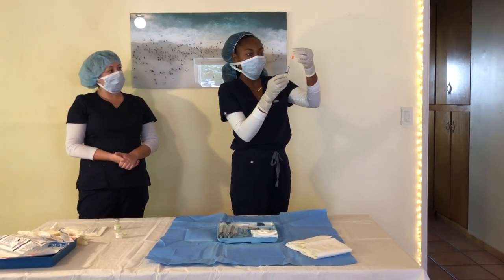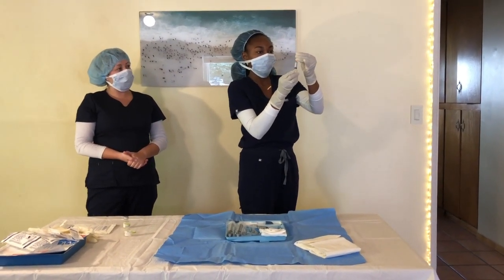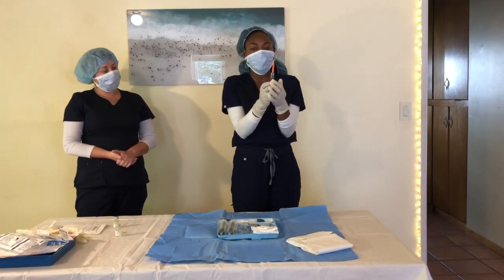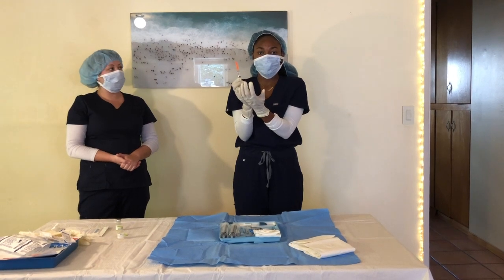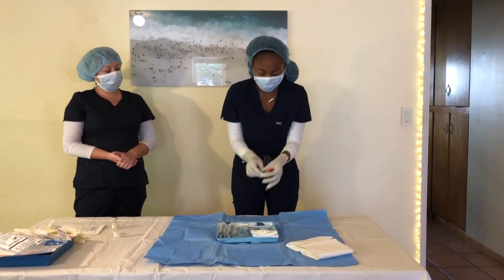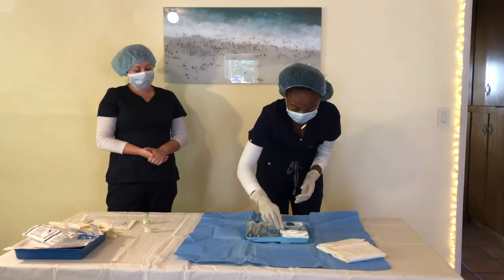Now I'm gonna put my cap back on. Some people also like, so that they never touch the needle, to draw it like that, but to me that can be difficult, and then I'm at a higher risk of dropping it off the table. So I like to just hold it and stick it right back on. So I have that, and I'm gonna put this back here for the radiologist.